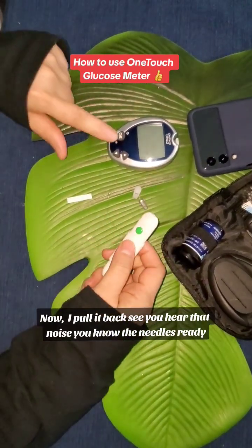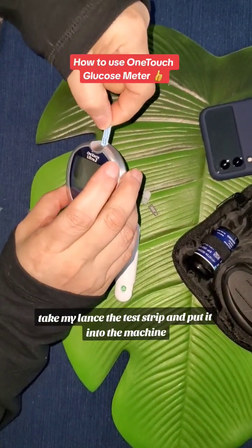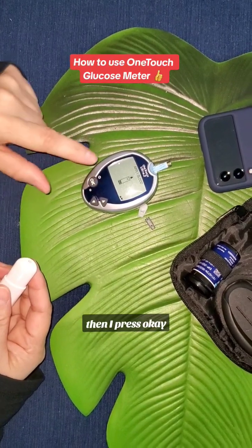Now I pull it back — when you hear that noise, you know the needle's ready. I turn on my machine, take my lancet, take the test strip, and put it into the machine. It's going to automatically come up on the screen. Then I press OK. Now you see it says 'apply blood.'